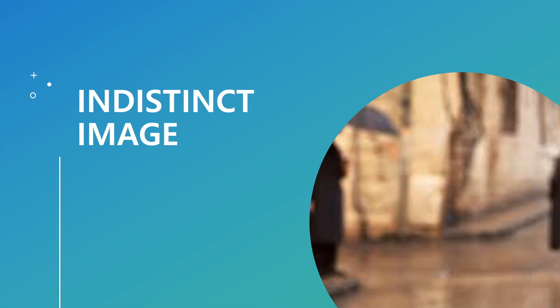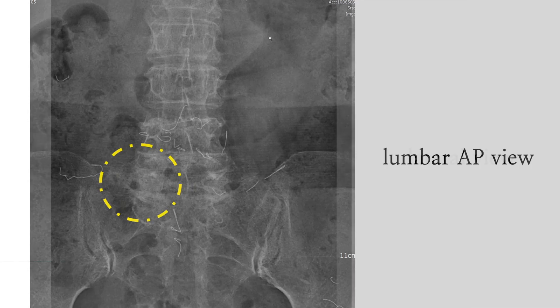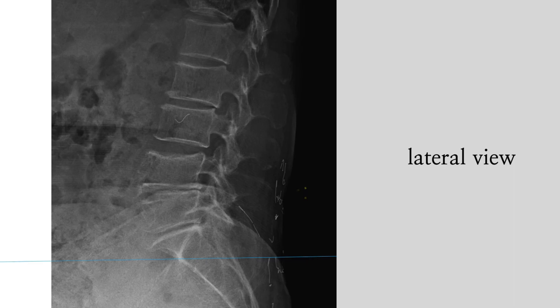Indistinct image — it is the first challenging type. This is a lumbar AP view, and my target is right L5 nerve root. I cannot see the distinct cortical margin of structures such as the inferior border of the transverse process and lateral border of the inferior articular process. The leading cause of this faint image is osteoporosis in this patient. She has implanted multiple acupuncture needles. In the lateral view, there is narrow disc space at L4-5 and L5-S1, and normal inclination angle of L5.